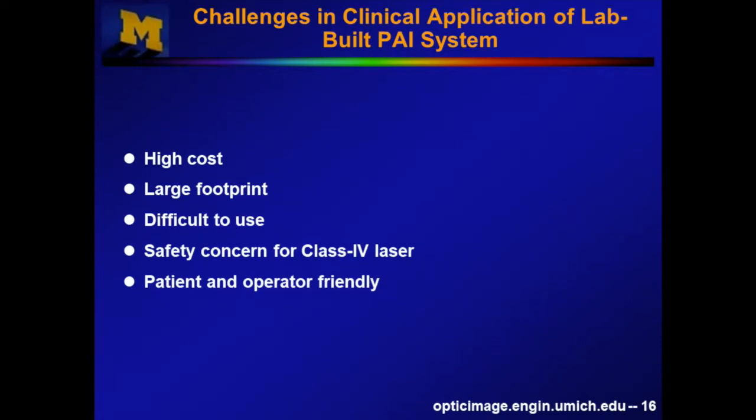The rheumatologist, radiologist, and our technicians, when they use the system, have to put the goggles on before they can turn on the laser. That also makes the system not very friendly to patients and operators, because the patients also need to wear the goggles during the scan of their fingers.